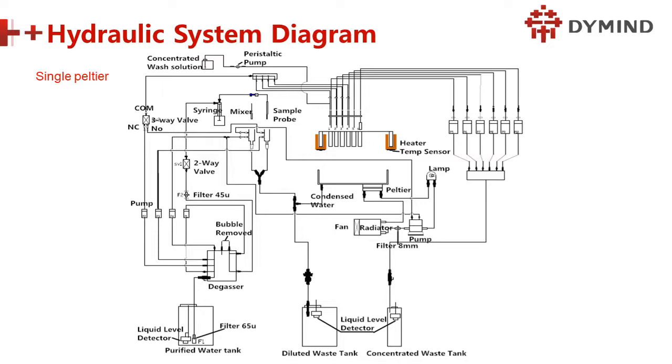So this part is the most important one. For software and for calculating is here. So this system we call the reaction system. But our machine is multi-use, right? So if I want to do multi-use, then we need cleaning, right? So you can see the other steps, left or right of this part, except the cooling system for the lamp. The lamp sends a signal passing by the cuvette. So except this part, the others are for service.